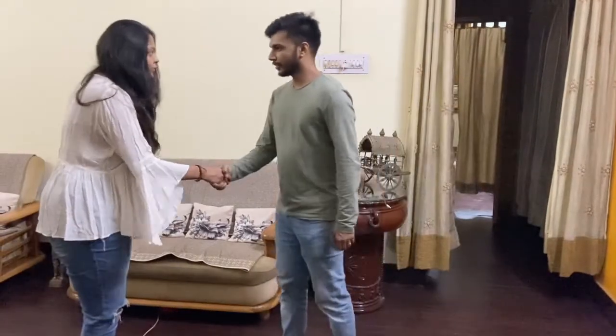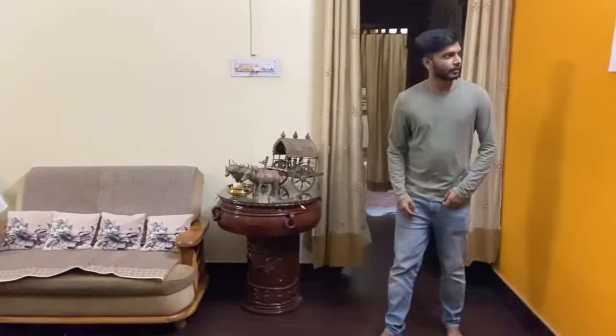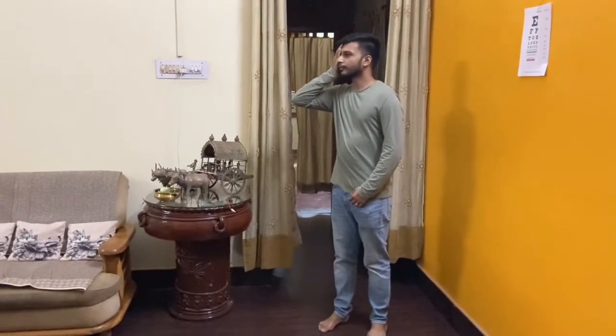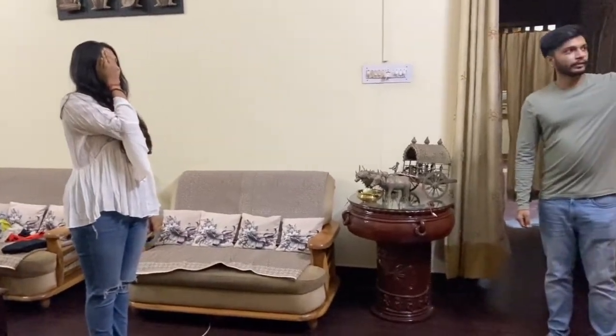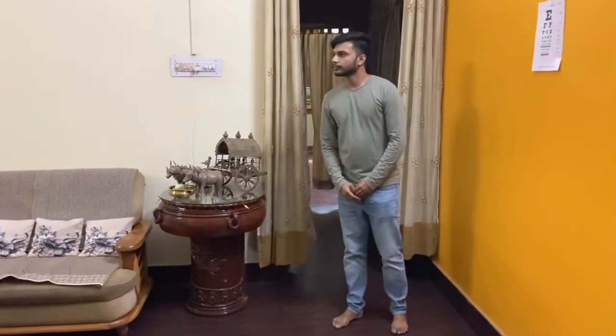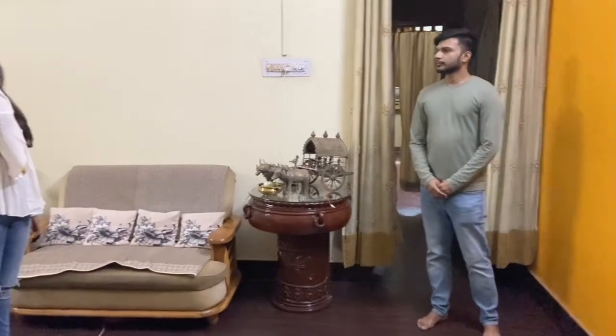For the eye examination, first comes visual acuity. For this, I asked my patient to stand 20 feet from the Snellen chart. I asked her to cover her right eye and read the smallest line of letters that she can still identify. I asked her to repeat this by covering her left eye.